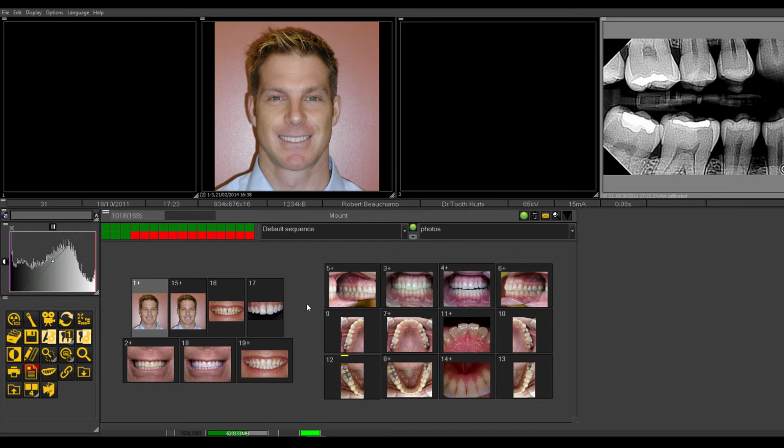There is normally an area where these images are going to be downloaded into the software and interfaced with the imaging software. And there is a protocol that is going to be followed with every new patient, or every time they're going to be using the handheld SLR camera.